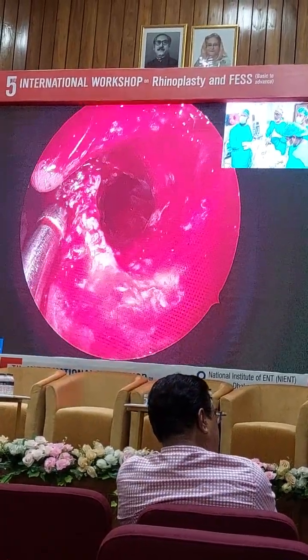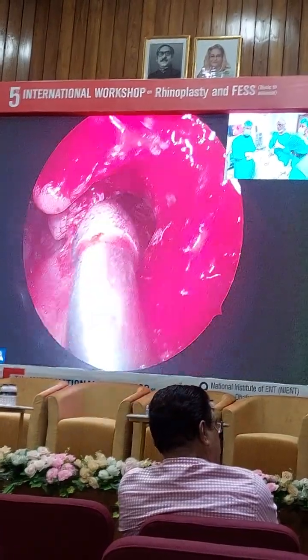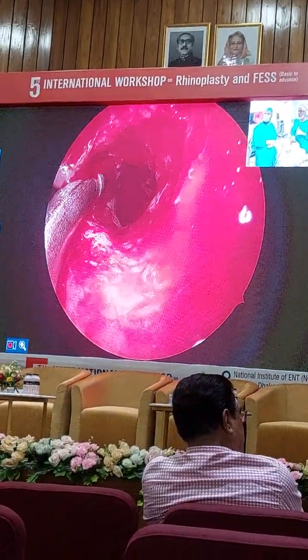So we have a little more of this maxilla which I can widen. So this part of the uncinate we need to take out.